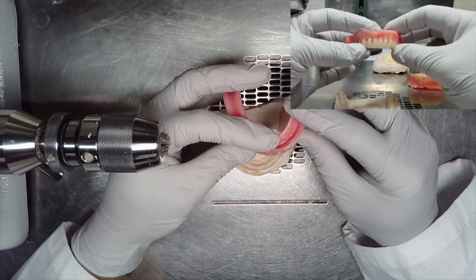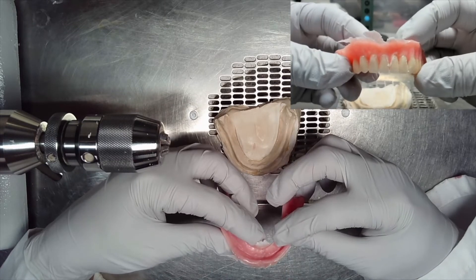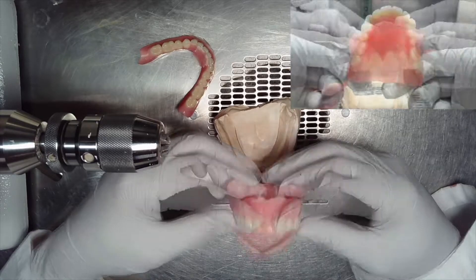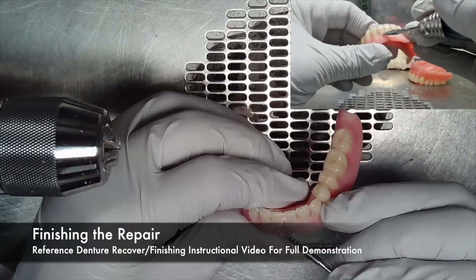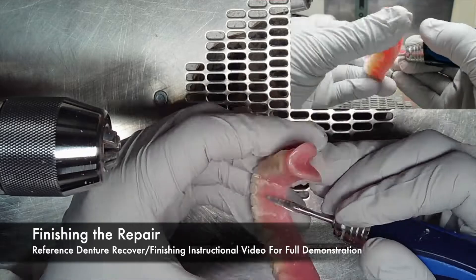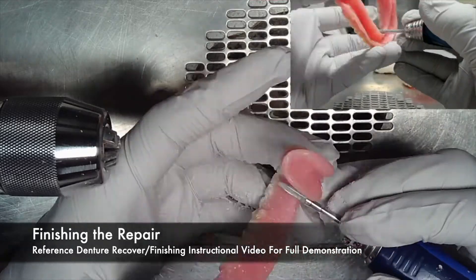Be sure to evaluate the acrylic work itself. Be sure that the acrylic filled all the voids all the way into the intaglio of the denture and that there is no porosity or bubbles. Once the acrylic is verified, you can begin all the finishing steps. You can reference the denture recovery and finishing instructional videos for a full demonstration on how to properly finish and contour a denture.